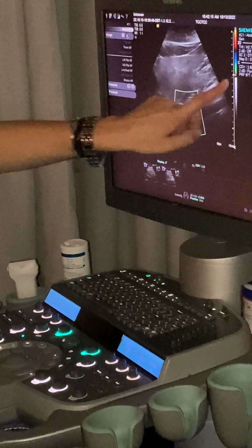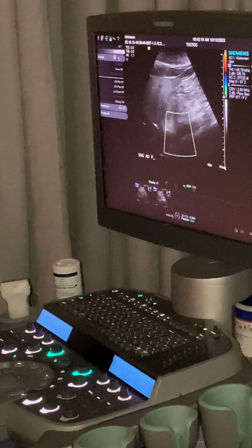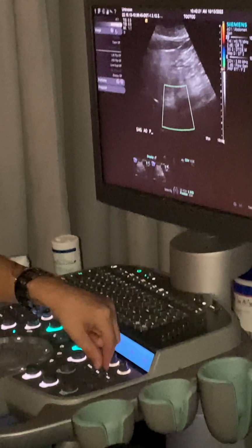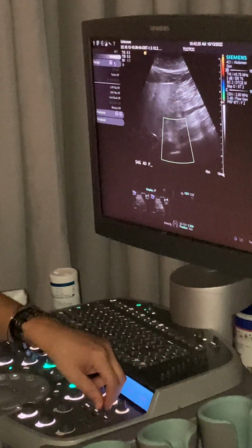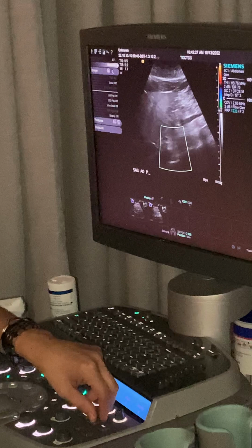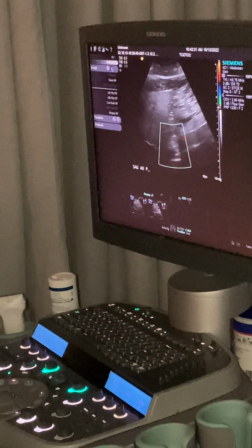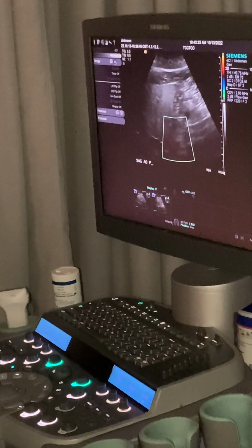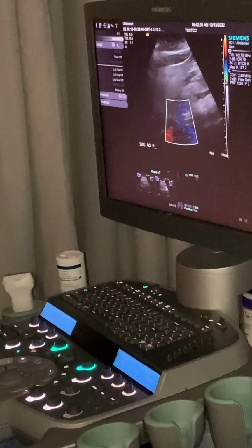So it's gonna set me up at 15 centimeters per second, which is a little bit low velocity. And so there's a button over here called scale. So that's our PRF, our scale, our velocity. So we're gonna raise this up a little bit. And these machines are notoriously terrible at color flow. These two are amazing at it. So when you guys are doing your protocols and you need to get color, try to get yourselves on those machines. Okay, big breath in a little bit again.